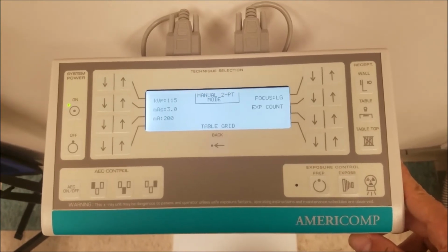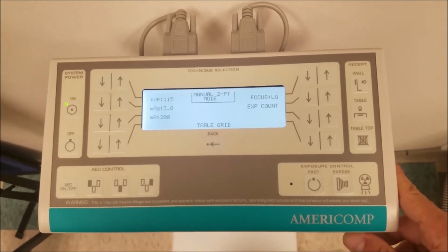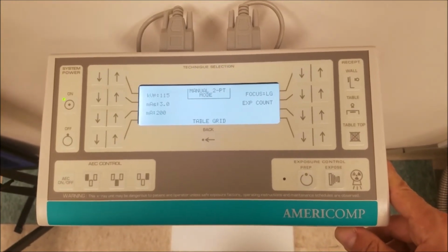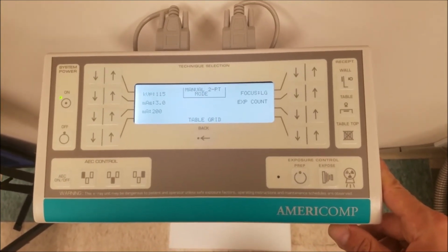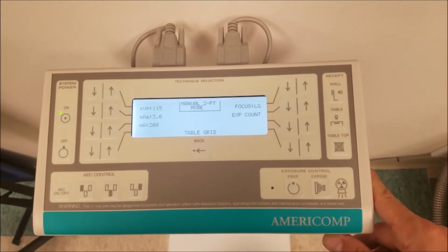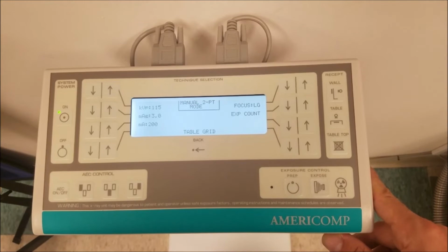Next, I'm going to talk about digital radiography, also known as DR. This is a direct acquisition system. This system will give us an image sent directly to our monitor.